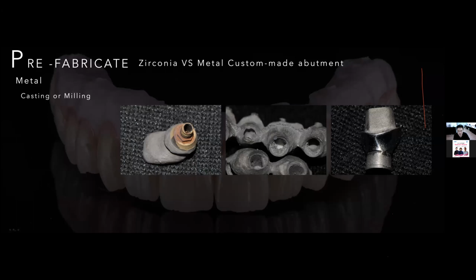Another big problem in the laboratory is that it is not easy to cast the final custom abutment precisely, because we need to wax up on the cylinder, and when you cast the semi-precious alloy on it, sometimes it is not easy to cast very well or precisely.